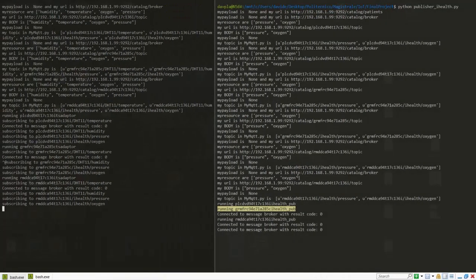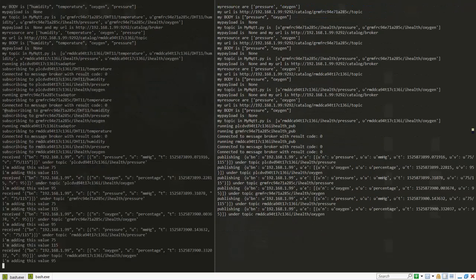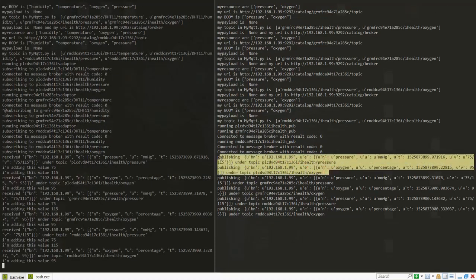The requests are done every 50 seconds. As we can see, an SenML for pressure and oxygen related to the first patient has just been published, an SenML for pressure and oxygen related to the second patient, and as well for the third patient.